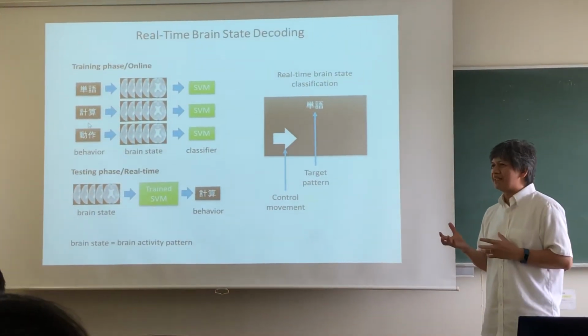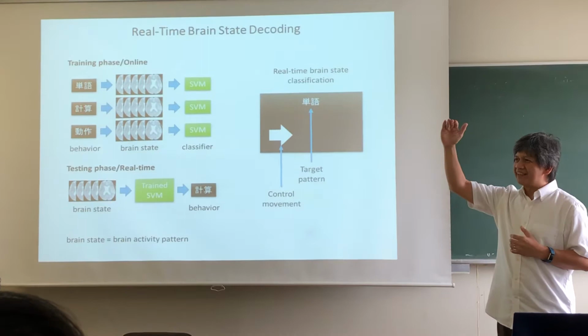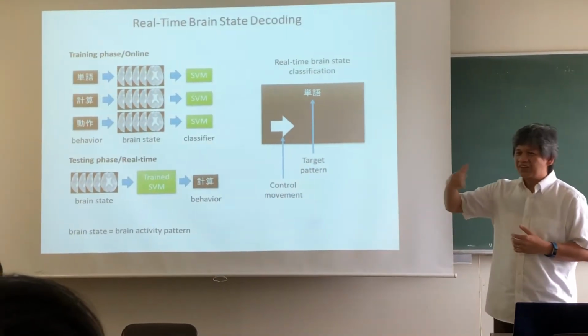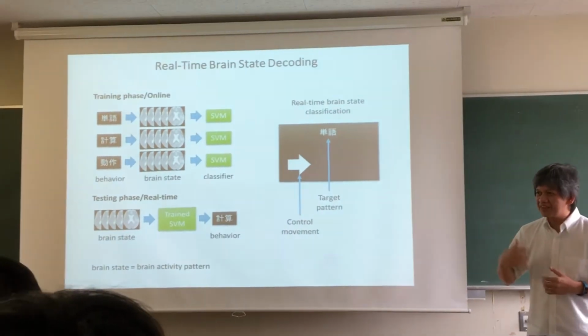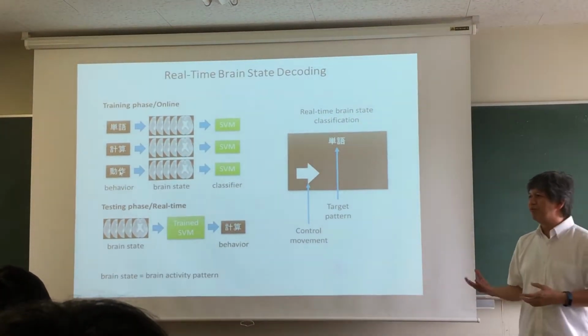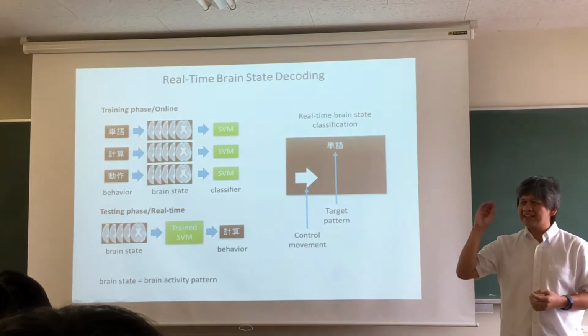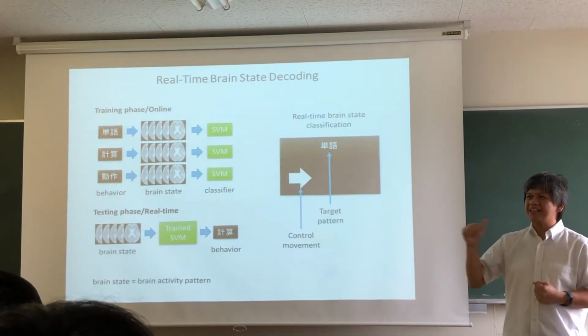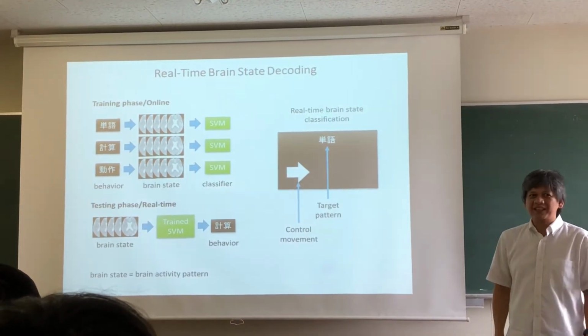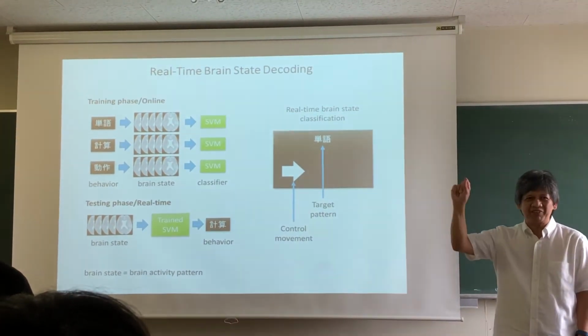Here we ask the participants, starting from 100, to subtract 7 until you reach 0. So you have sequential subtraction. And then finally, the third task is just movement or motion, wherein we ask the participant to do imagined tapping. You are not really doing the actual tapping, but you just imagine that you are tapping your fingers.